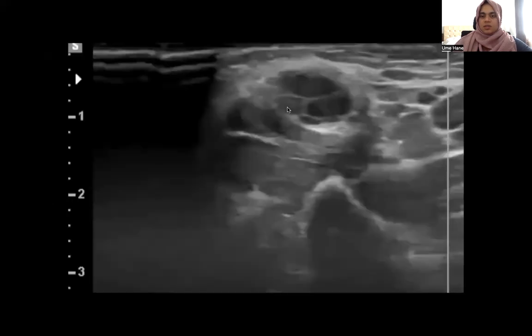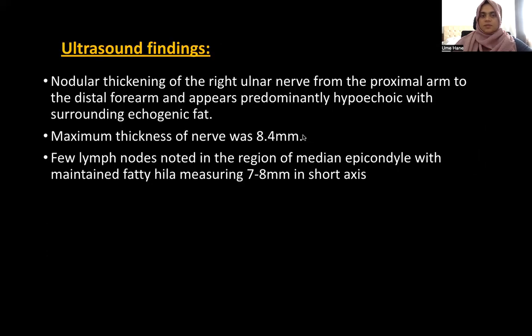This is again showing the ulnar nerve in cross-section. Our ultrasound findings showed marked thickening of the right ulnar nerve from the proximal arm to the distal forearm, which appears predominantly hypoechoic with surrounding echogenic fat. Maximum thickness of the nerve was 8.4 mm, and few lymph nodes were also noted in the region of the medial epicondyle with maintained fatty hilum measuring 7 to 8 mm in short axis.